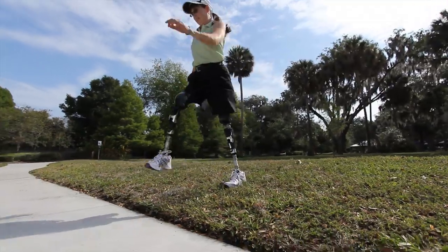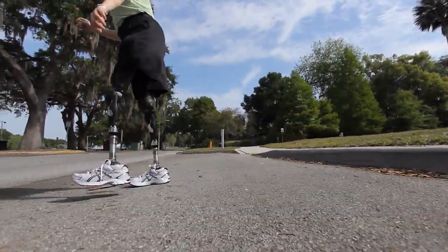It does have stumble recovery, and most people say you don't need it. Well, yeah, I do, because there are times it kicks in, and I'm very grateful that it's there. So that's why I love the Plie.